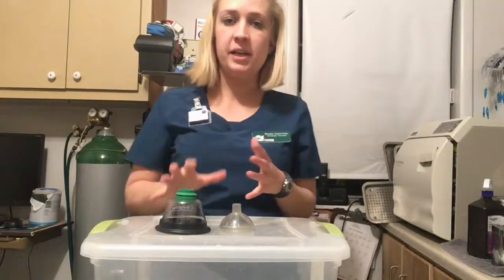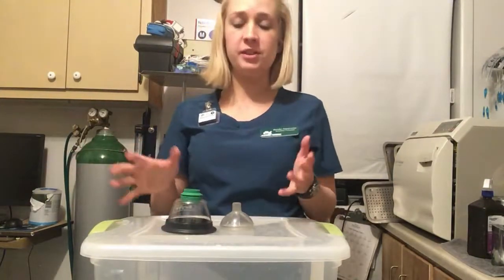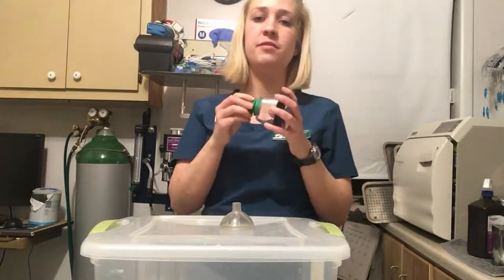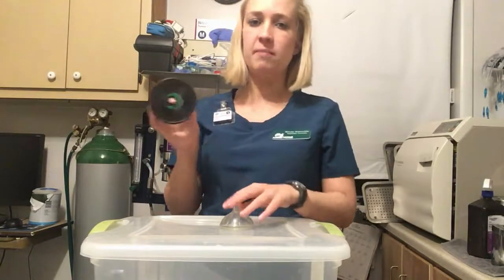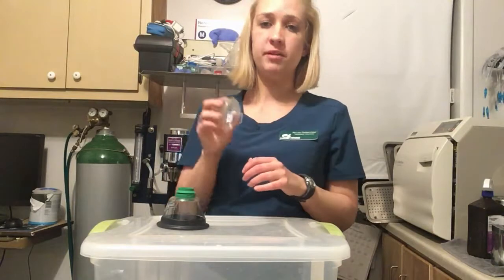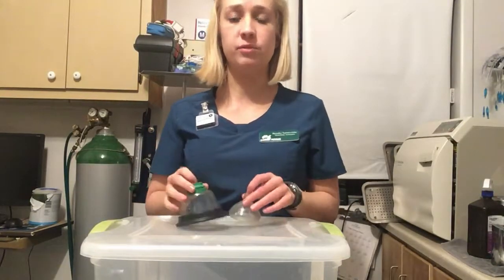Sometimes you may be inducing the patient through inhalation versus intravenously. There are two ways to do that. First is with masks, and the mask will be attached to the end of the circuit. This rubber part right here will go over their muzzle. There are different sizes of masks. There are small, tiny ones that can be used for cats and even smaller animals, growing up to different sizes based off of how large the animal is.